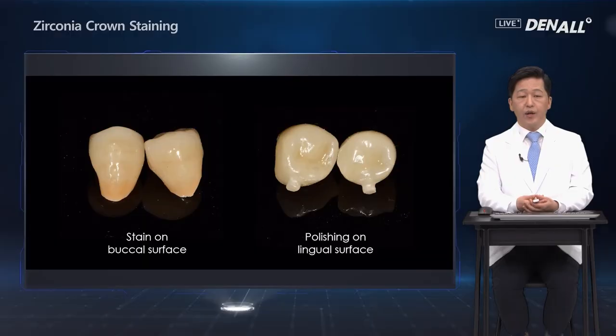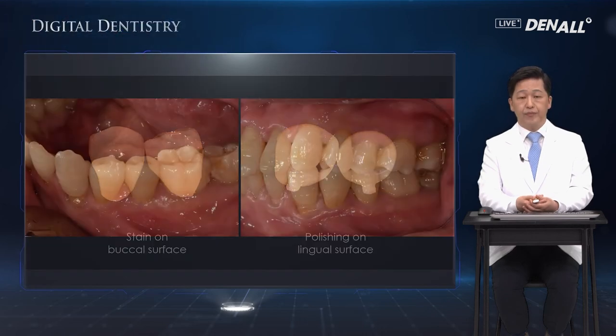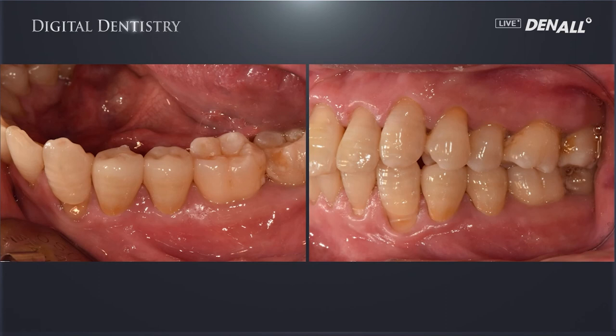So this is how the staining is completed. Staining is done on the buccal side and the grooves primarily. On the cusp and the lingual area, polishing is used. Finally, the crown is delivered. As you can see, the crown is almost the same as the adjacent tooth and the tooth before the procedure. When the color of the patient's teeth has character and is very unique, staining should be done.